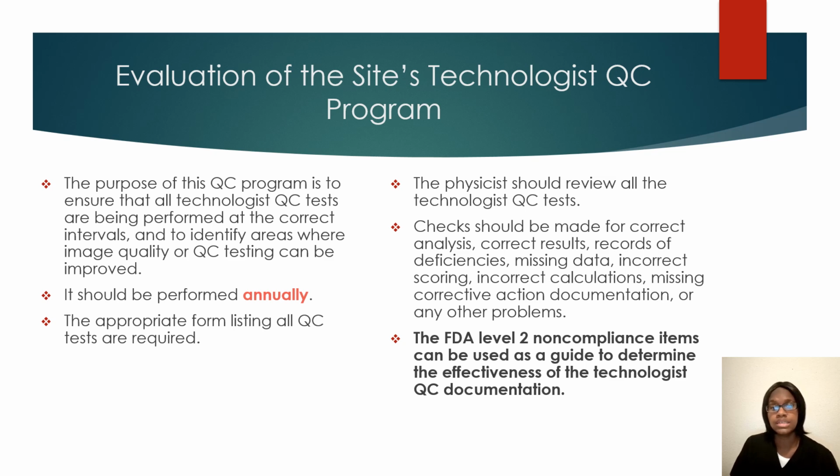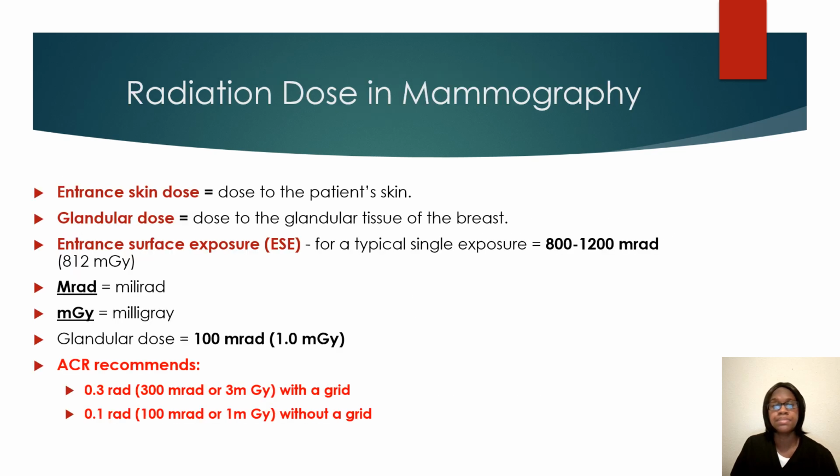I know at the facility I work for, the radiologists normally review the QC books, making sure that everything is correct. There are no missing words, numbers, or items, making sure everything is scoring correctly, and making sure that everyone is filling out the book correctly.